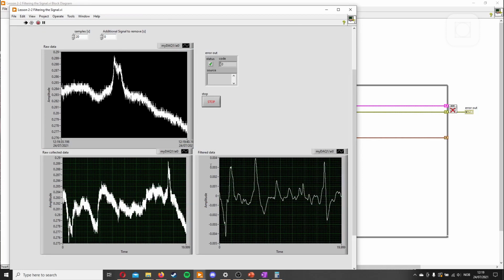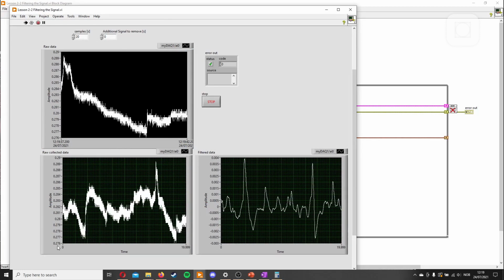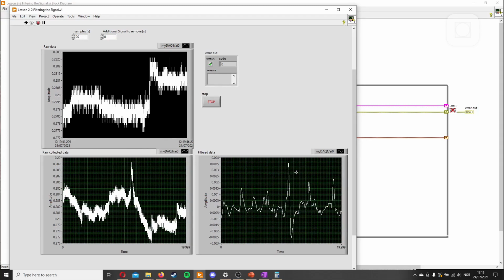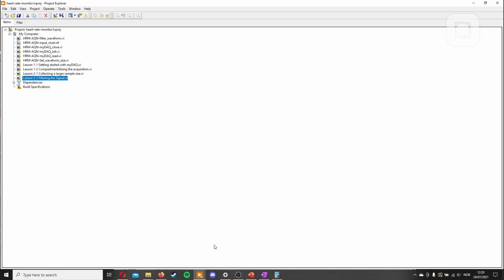So here you see the range here is a lot higher too because filtering weakens the signal, but we also have a much smoother waveform. And that's it for this lesson. And in the next lesson, we will finish up the simple heart rate monitor.